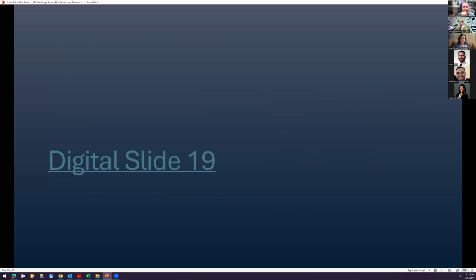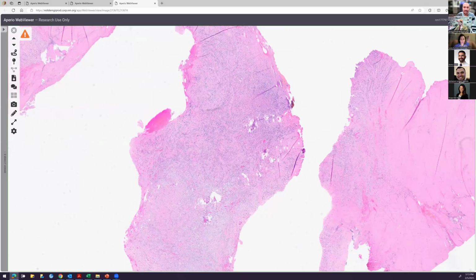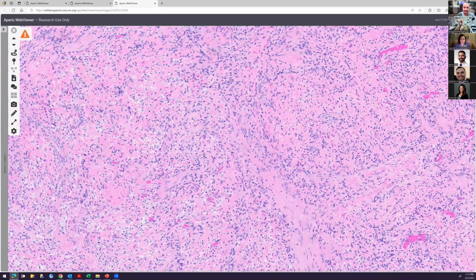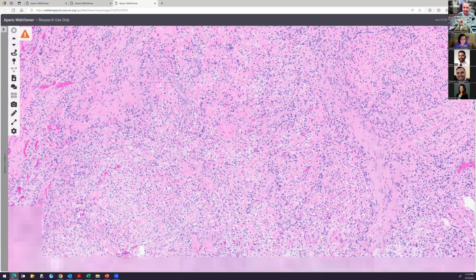Cool. All right, let's move on to the next one. Here we are. Okay. Yep. All right, so here's the next one. I won't tell you where this is because the location is kind of weird, so I'm not gonna confuse you guys with it. But what do you guys see for this tumor? What about once this kind of settles in? What about architecturally? Kind of what are we looking at here?